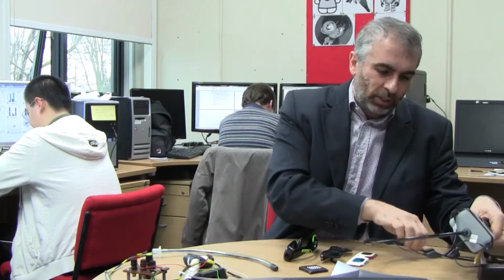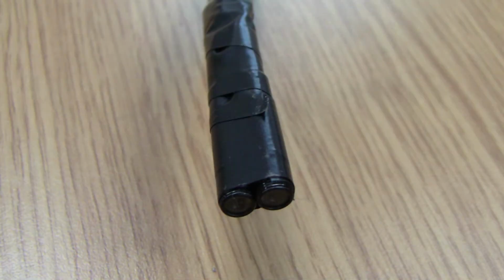Once we did all this, we had proved that there was potential, and then, having worked on a simulator, we wanted to try a more realistic setting. So we built a hardware prototype of our simulator, of our bronchoscope. This is our first prototype. It's an endoscope for engine inspections, which we have, of course, adapted. We put in 2 7mm cameras that include LEDs, and we tried it on a mannequin to see how performance would change between simulator and a real system.